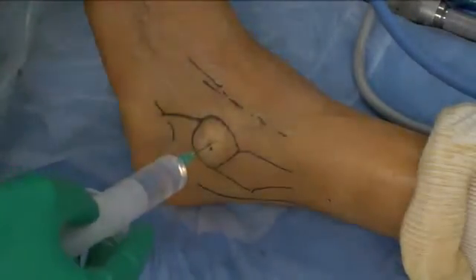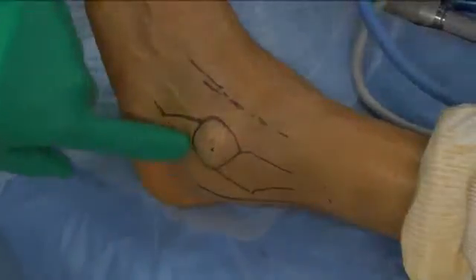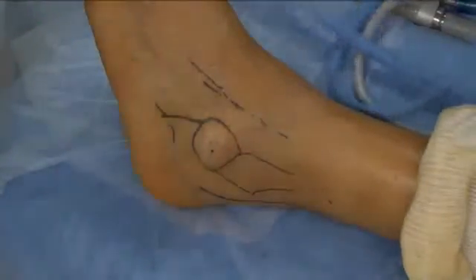An inflated zone on the skin may be seen and should correspond to the circumference of the sinus tarsi outlined earlier.